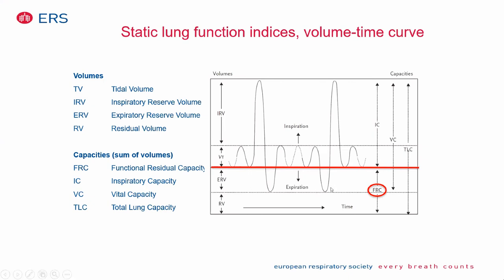And that's the first measurement that you obtain in the body. It's the FRC. From this one, then you combine some slow measurements where you can measure volumes. And then you have here these different volumes that you can measure: inspiratory and expiratory reserve volume, or the tidal volume. And you can also calculate the residual volume by subtracting expiratory reserve volume from the FRC.